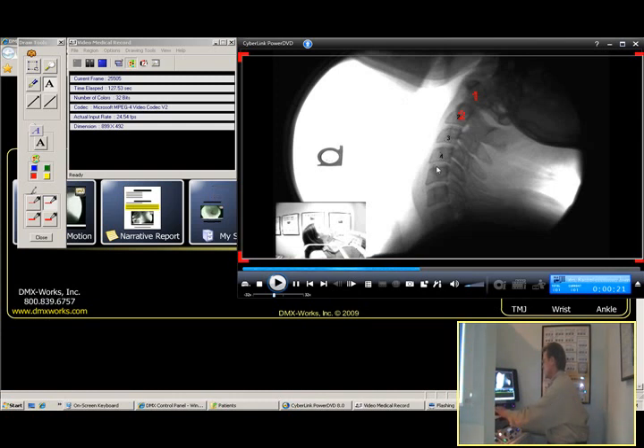One, two, three, four, five, six, seven. As you can see how fast and easy that is — it's amazing. Now I'm going to draw the arrows. It goes real quick, and coincidentally it's at the same levels: four on five and five on six. Only this time the vertebrae have slid backwards into what's called a retrolisthesis.